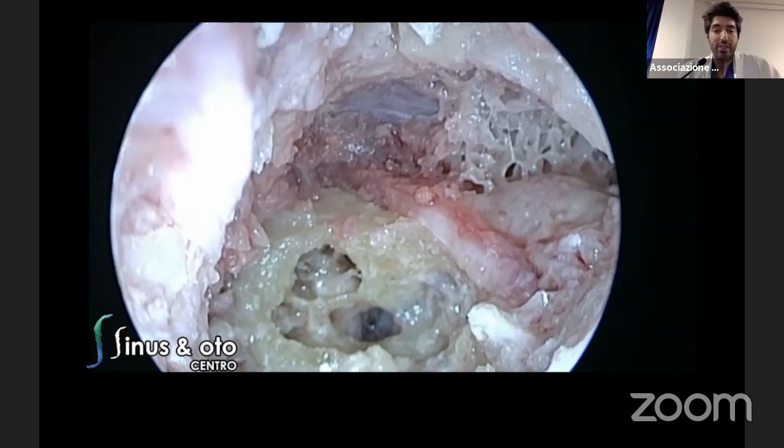Of course, the thing is that when you're performing any kind of procedures live, or I mean in a patient, you will see the blood flow. And what happens also if you're touching those structures? So I think that in order to do this, you have to present some practical cases. However, I do think that what you have done until now for presenting cases and anatomical structures in a cadaveric study is essential.